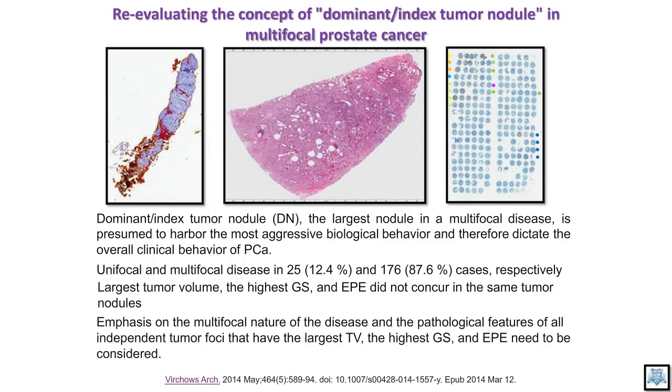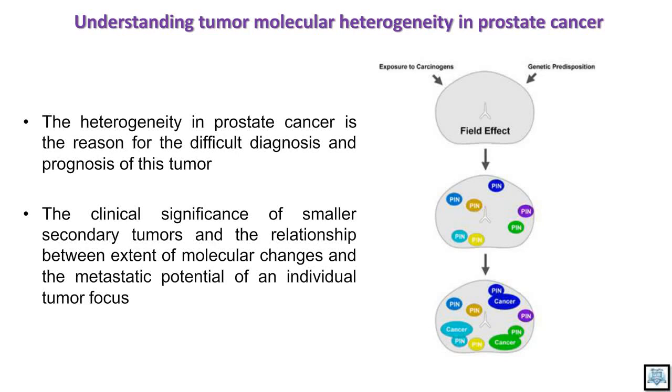It is for that reason that many major centers started adopting the whole mount prostate tissue analysis rather than looking at only the dominant or index nodule. With that idea in mind, we wanted to study the tumor heterogeneity in prostate cancer. As you know, the heterogeneity in prostate cancer is the reason for the difficult diagnosis and sometimes prognosis of the tumors.